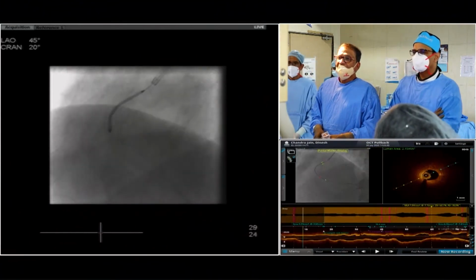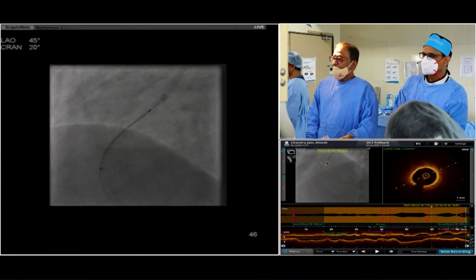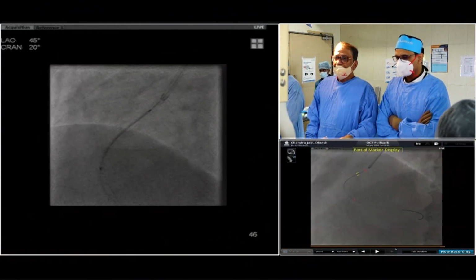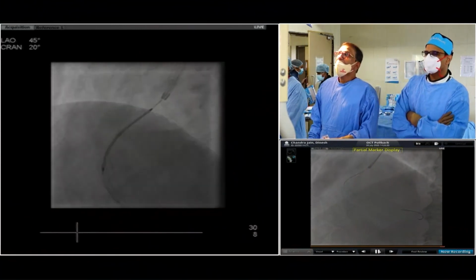Yeah, I know. I have come up proximally. I saw your landing zone. Stent boost is not ready, Chinna.